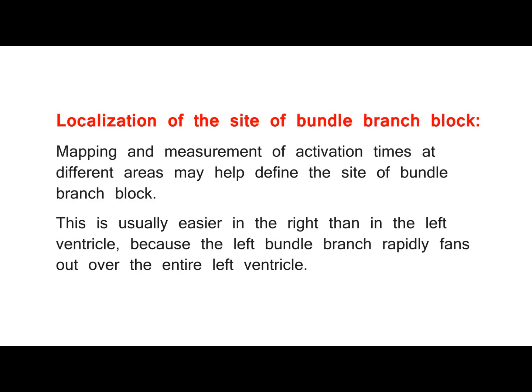Localization of the site of bundle branch block. Mapping and measurement of activation times at different areas may help define the site of bundle branch block. This is usually easier in the right than in the left ventricle, because the left bundle branch rapidly fans out over the entire left ventricle.